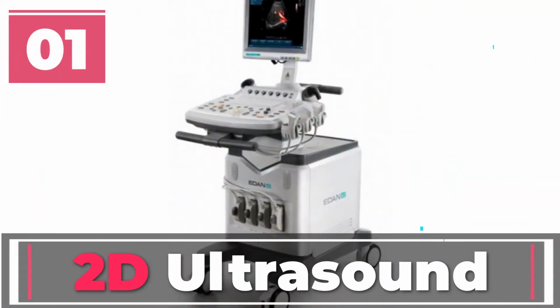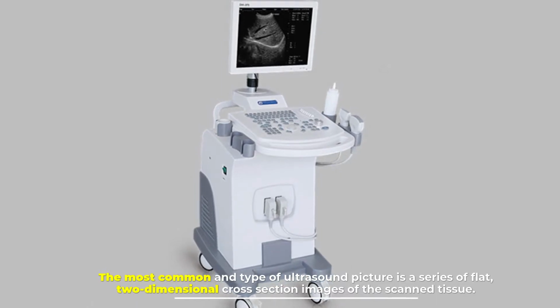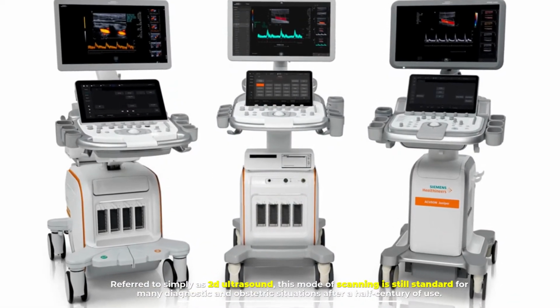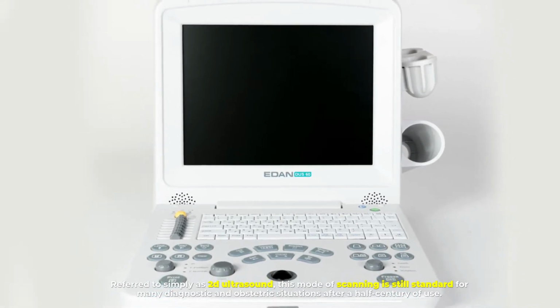Number 1. 2D ultrasound. The most common type of ultrasound picture is a series of flat, two-dimensional cross-section images of the scanned tissue. Referred to simply as 2D ultrasound, this mode of scanning is still standard for many diagnostic and obstetric situations after a half-century of use.